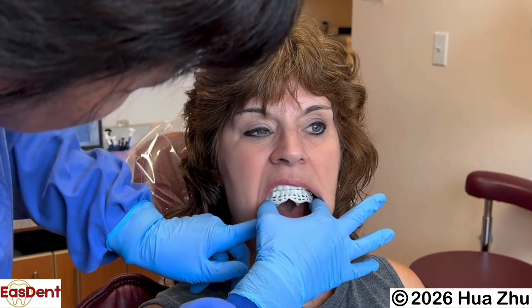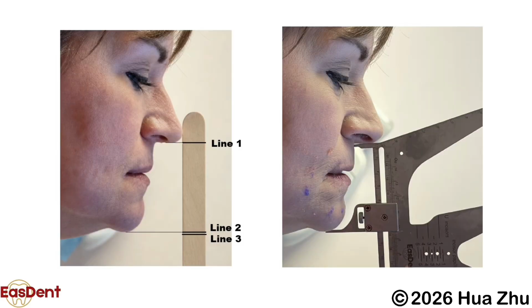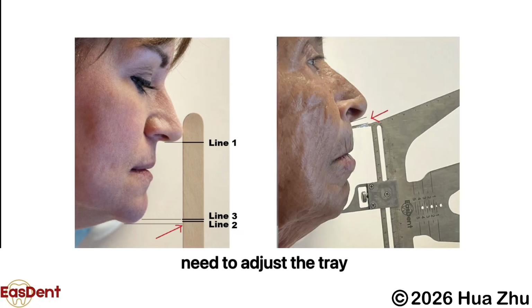Hold the mandibular tray there, let the patient bite down in centric relation until the mandibular tray touches the tissue at the first spot. Use a tongue blade or Easdent measure to check the preset starting VDO. If the distance between the lower border of the septum of the nose and the lower border of the chin is bigger than the preset starting VDO, or the tray is pinching at the tissue somewhere when the distance is at the preset starting VDO, you need to adjust the trays first.